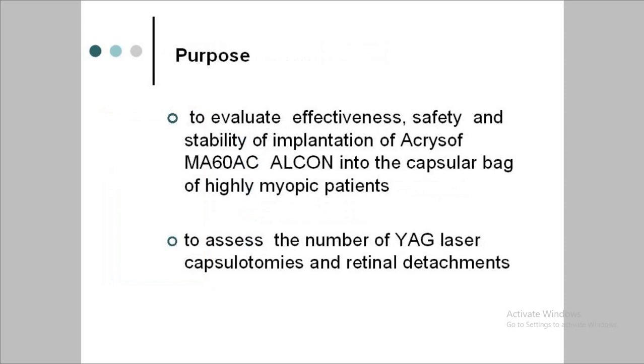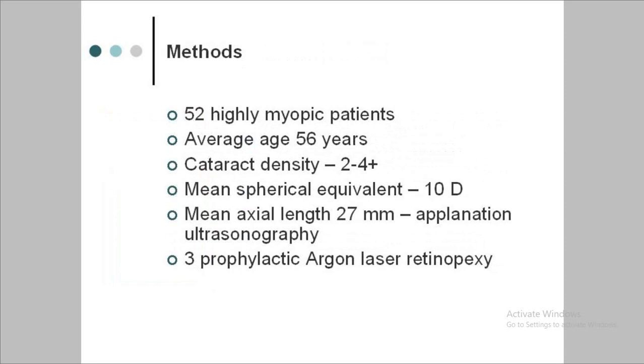It is AcrySof MA60AC of Alcon, soft acrylic foldable lens, multi-piece with optic size 6 and length 13 millimeters. Our purpose was to evaluate effectiveness, safety, and stability of implantation of this IOL, AcrySof MA60AC, into the capsular bag of highly myopic patients and to assess the number of YAG laser capsulotomies and retinal detachments. 52 highly myopic patients, average age 56 years, cataract density 2-4+, underwent cataract surgery, phacoemulsification. Their mean spherical equivalent was 10 diopters and mean axial length 27 millimeters. In cases of severe retinal degeneration, argon laser retinopexy was performed in 3 cases.